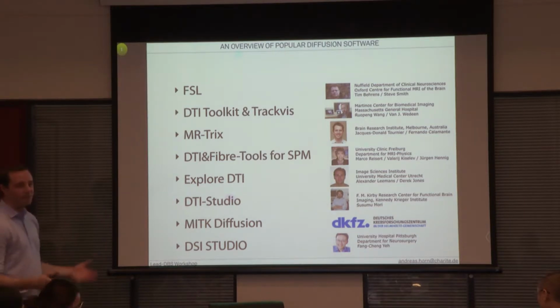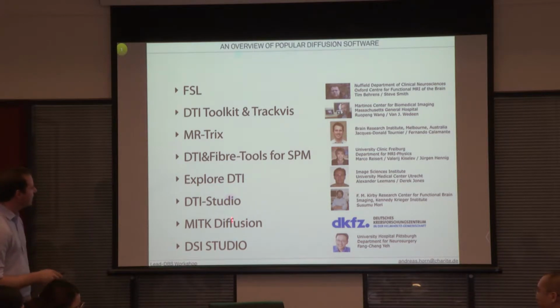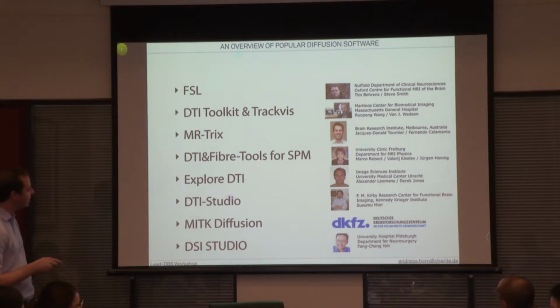And it's all in MATLAB, so it's also easy to use, well documented, it's free, and so on. Then there's DTI Studio, and I have not used that, but Susumu Mori was one of the first people who really did tractography and fiber tracking and so on. And then there's a German product which is also pretty nice and easy to use. It's called MITK Diffusion. Also has a Gibbs tracker adaptation, so also has this global tractography.